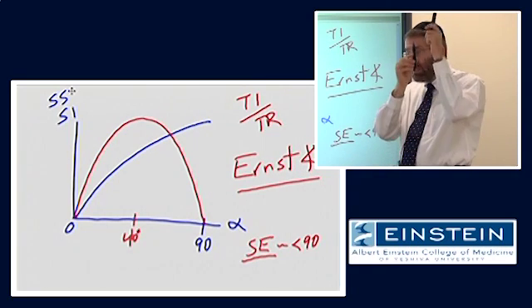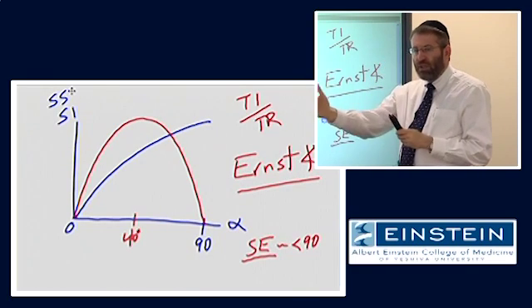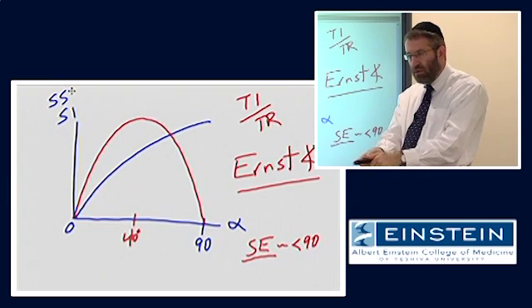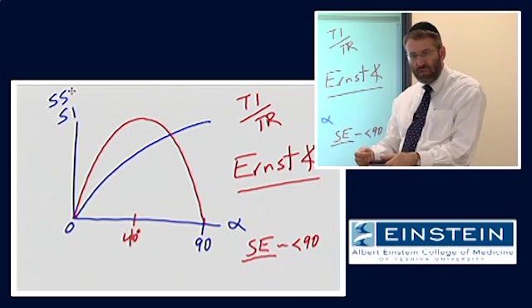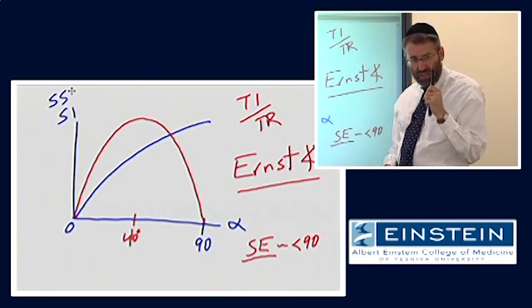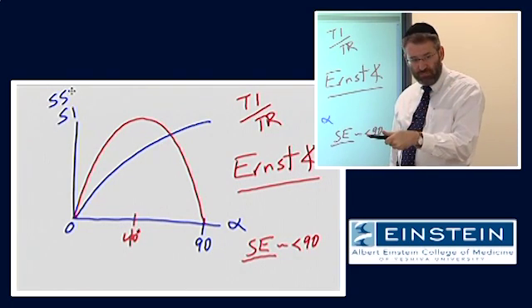Their T1s are different, but we don't see it because we wait so long. If, on the other hand, we shorten our TR, so we generate this signal, and before they fully recover, we knock them down again, all of a sudden our signal has a contrast embedded in it. The two different tissues have different amounts of signal. That's a function of how much they recovered their longitudinal magnetization. We only see that difference when we use a short TR.